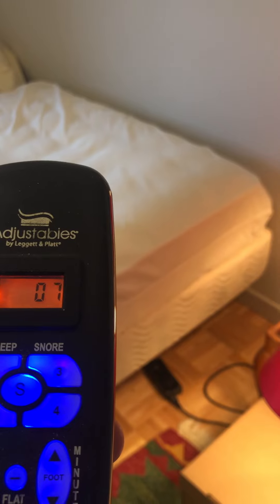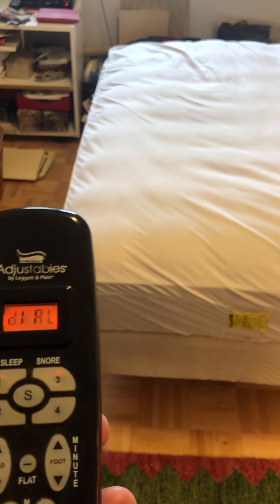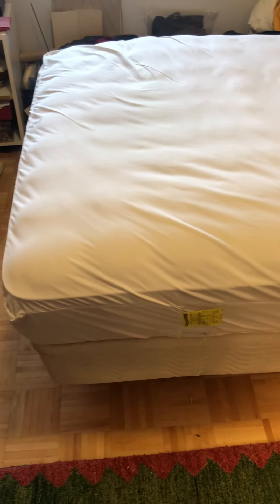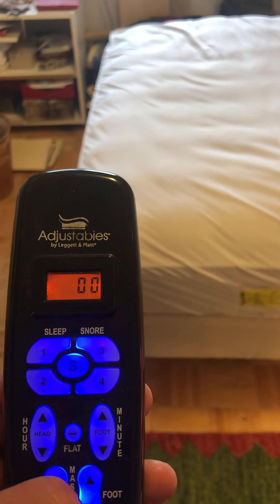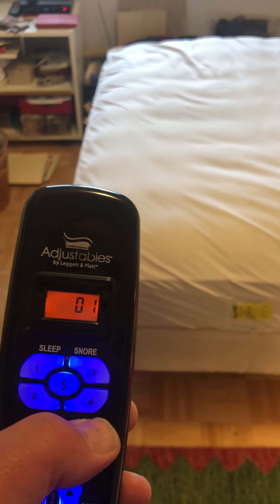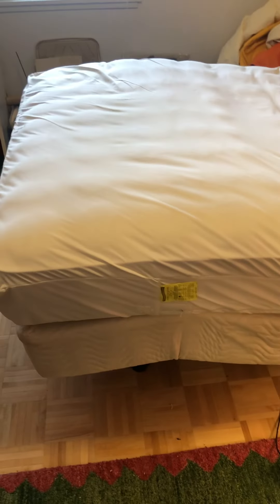It should go all the way to flat when it's at zero. Let's see if we can get the foot to show how it works. I'm using the wrong buttons. Now you can see the foot of the bed arcing up.